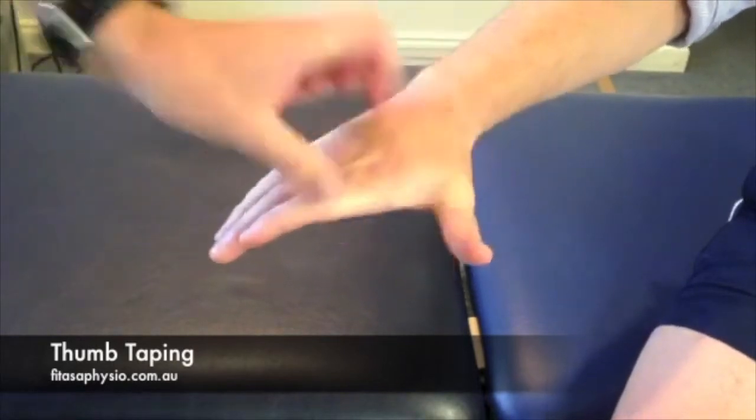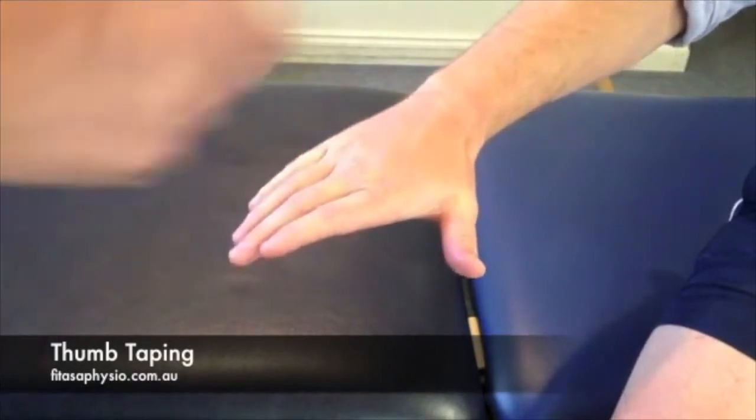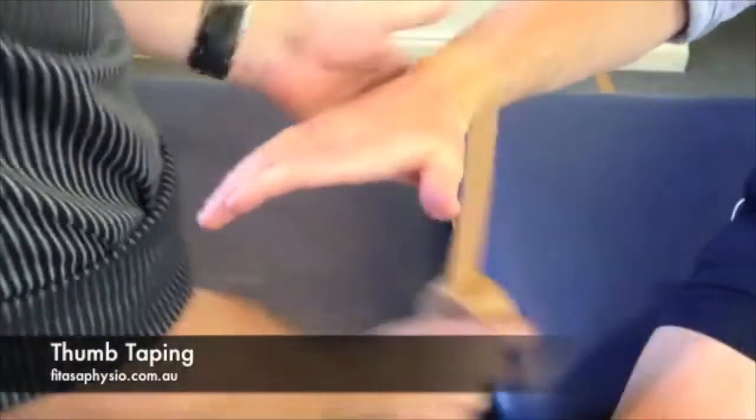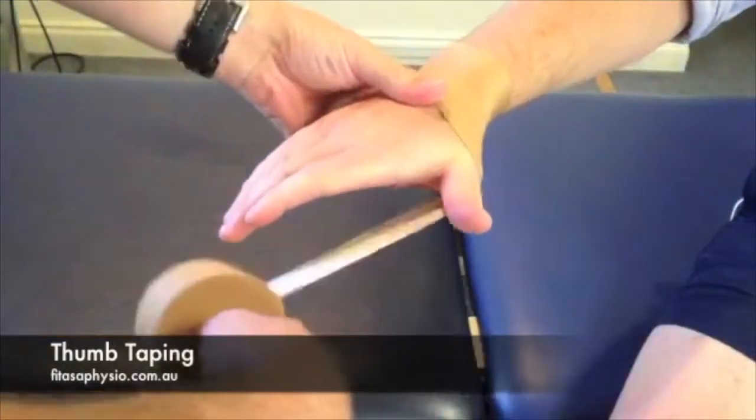I've got his thumb abducted. I like to have it palmed down, coming across the back of the wrist, starting with an anchor on the back of the wrist, looking at a figure of eight.